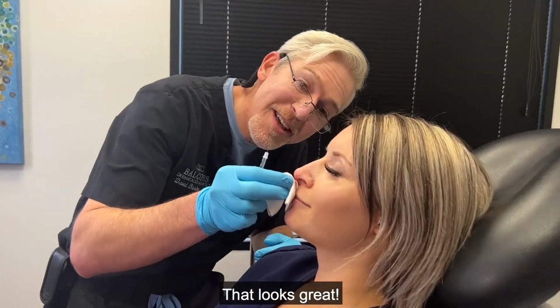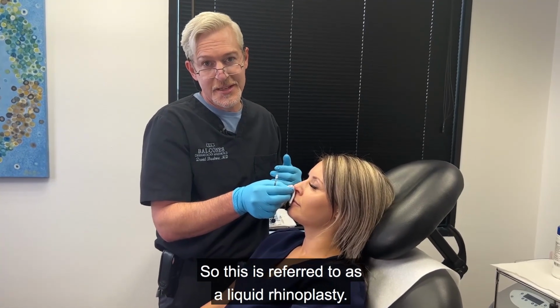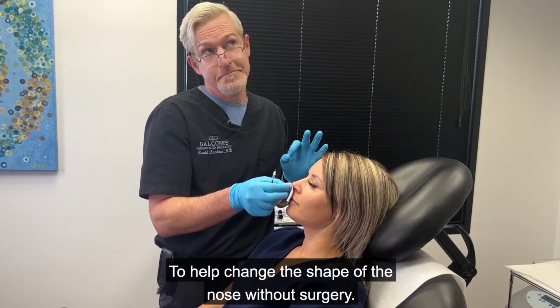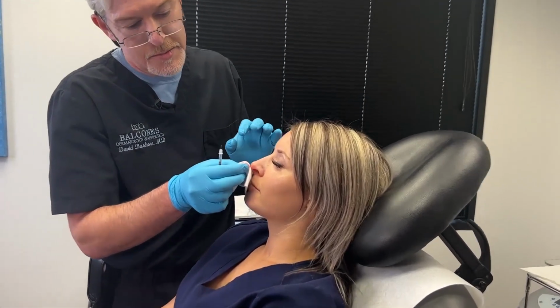That looks great. So this is referred to as a liquid rhinoplasty. So you use filler to help change the shape of the nose without surgery.